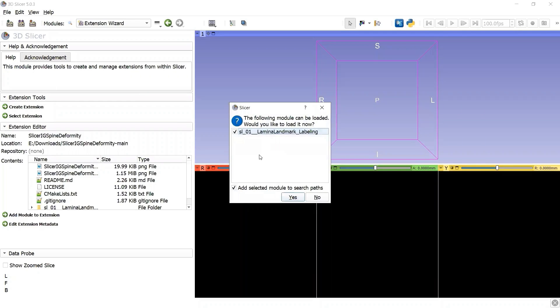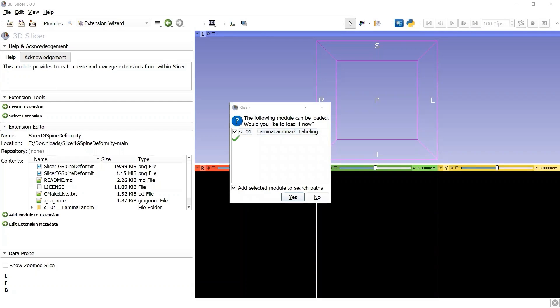Make sure that the module Lamina Landmark Labeling is checked, Add selected module to the search path is checked, then click the button Yes.